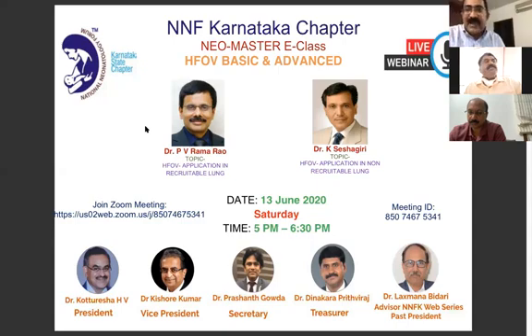And only that time, whether it is Sensor Medics or Fabian, you increase your I time from 33% to 50%, or indirectly, you're increasing your IE ratio from 1:2 to 1:1. So that is a very bad scenario. You could use that, but otherwise, usually in oscillation, it is fixed at 33% or 1:2.